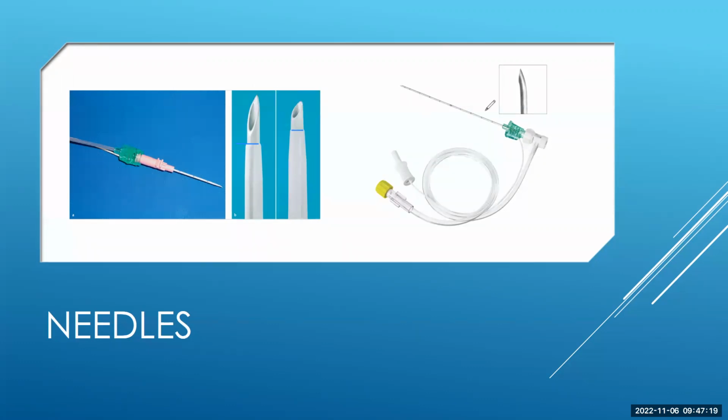The other is a little less likely. And the Tuohy is my all-time favorite because, while it's a little blunt going through certain fascial planes, those of you used to doing epidurals know we have some reliability that it's going to push stuff out of the way. Not vessels necessarily, but I do like that technique.